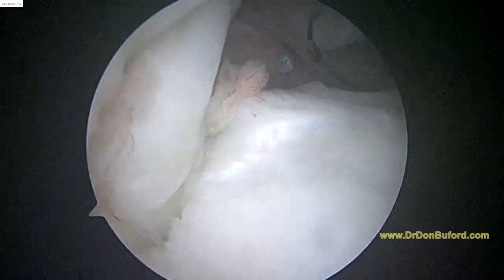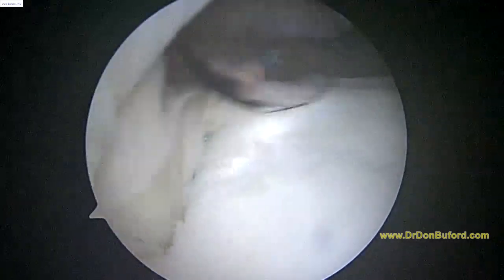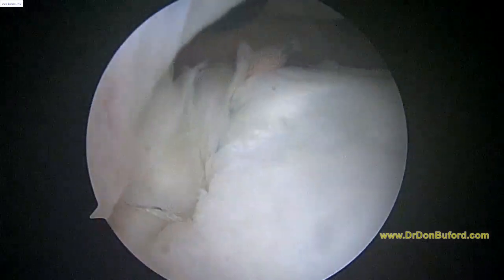And now this biceps tendon anchor is very stable. See, as I tug on it with the cannula here, it's not going anywhere. That anchor's not going anywhere. So I'm happy with that.